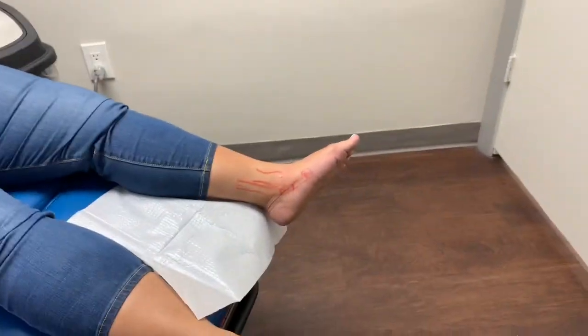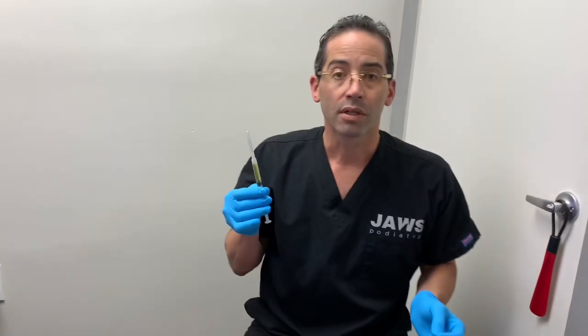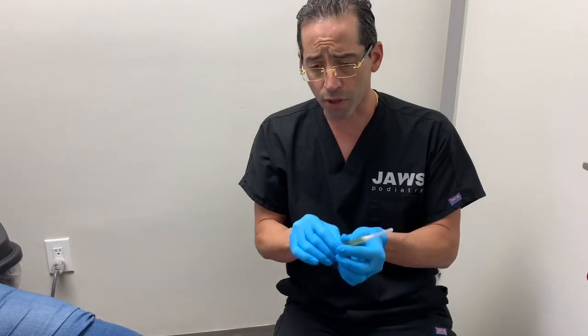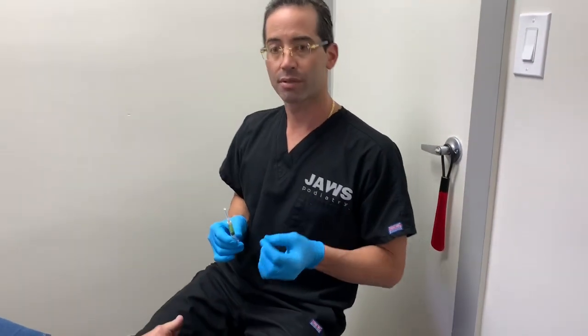Okay, so we're gonna go ahead now and take our PRP. Again, PRP stands for platelet-rich plasma. What do we have in here? We have isolated from a great quantity of blood the plasma, the platelets, which contain growth factors, important cells, important proteins, and I can get a little bit more scientific. I'm not going to do that, but this is like liquid gold, right? Healing the natural way. I love it. Passion.